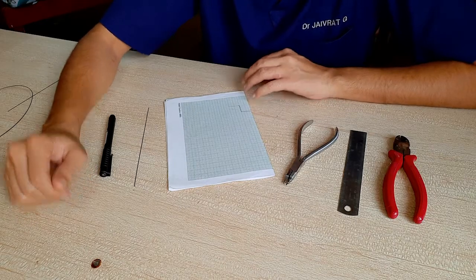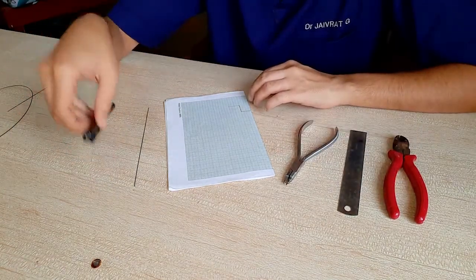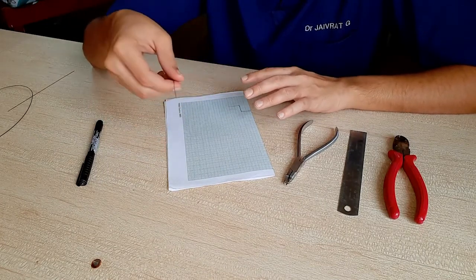So the things which you require for this are a plier, a cutter, a scale, a marking pen, and a straight wire — or an almost straight wire will also do.